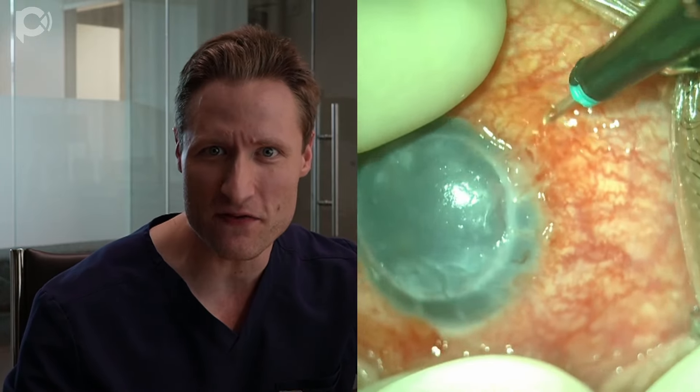I'd like to share a new surgical technique for DMEK graft unfolding that is particularly useful in really complicated eyes. This is a case we did just last week, and this eye is aphakic and aniridia with a decompensated PK and no visibility.